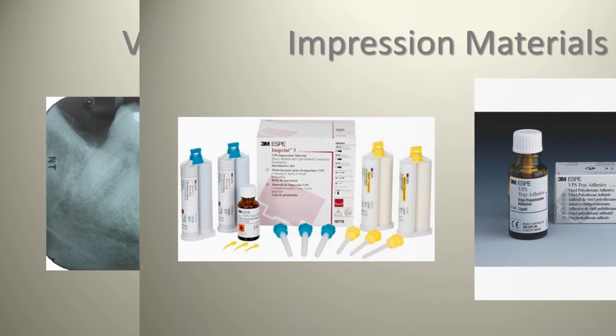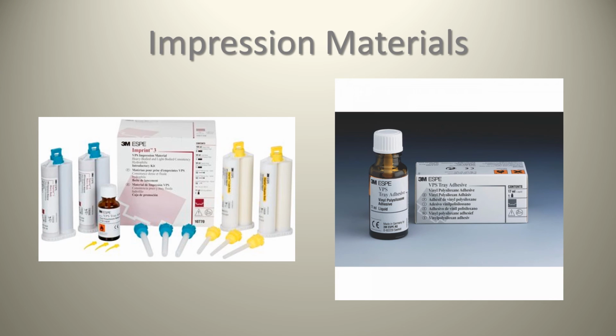Lastly, we're going to talk a little bit about impression materials. More or less, there's tons of impression materials out there. As I mentioned, there's the vinyl polysiloxanes, the polyvinyl siloxane, the Impregum, the polysulfides, the polyethers. You can even use alginate, though I wouldn't advocate you use alginate in implant dentistry, except perhaps if you're taking a mold of an opposing arch.